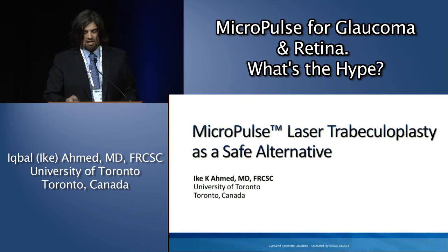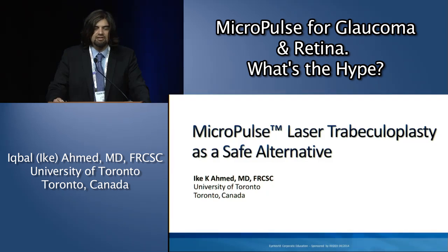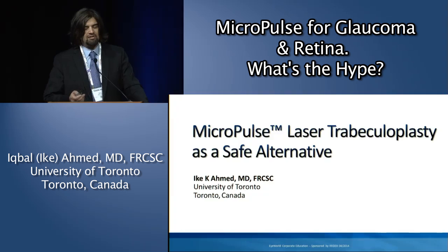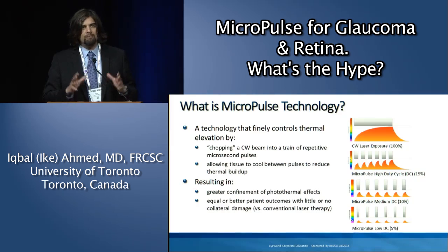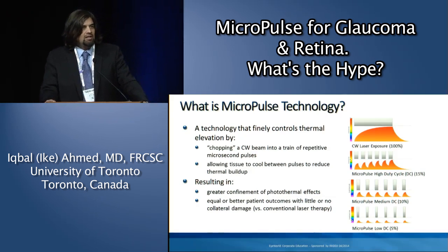So I basically entitled the talk here MLT for short. I love acronyms. MLT as a safe opportunity or an approach to laser trabeculoplasty therapy. So, we know lasers in ophthalmology, of course, have been around for many, many years and have been a mainstay of treatment for so many different conditions. And depending, of course, what we're treating, we've seen a lot of safety, and we've seen some areas where we need to improve upon. Remember, when it comes to laser therapy itself, we see a variety of different mechanisms.